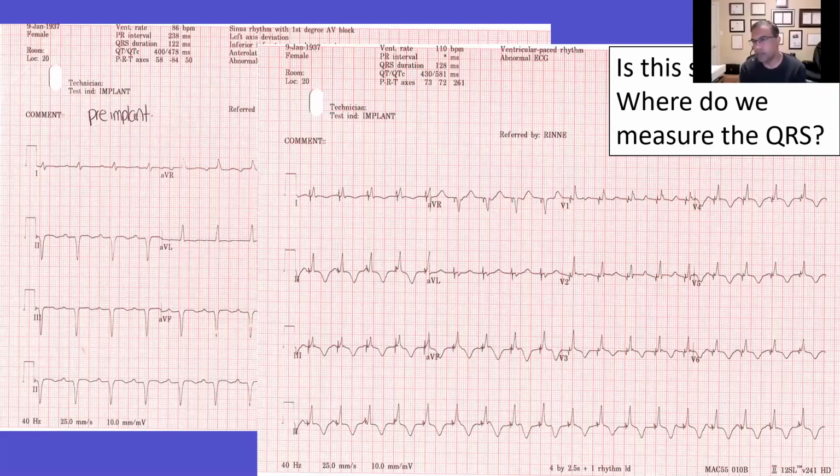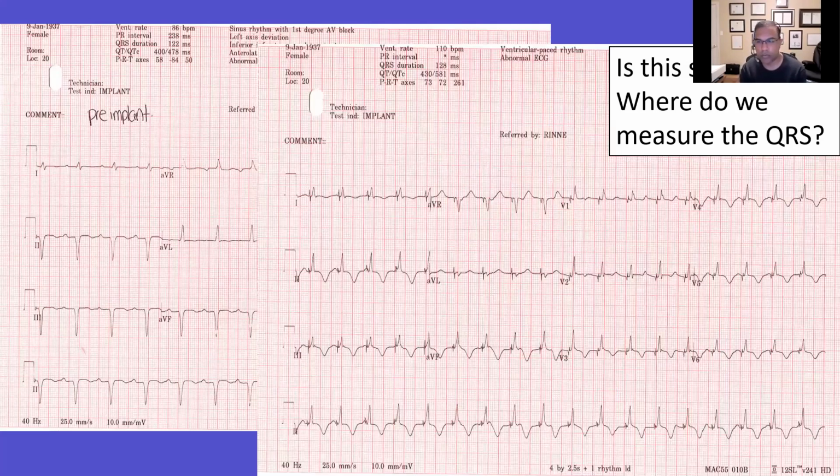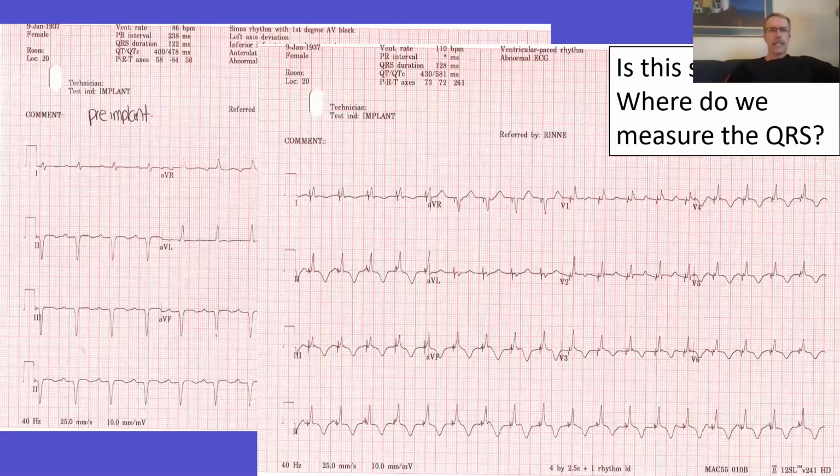It's usually measured in V1 by convention. Whether that is the right place to do it or the wrong place, that's where it is measured. And for the purposes of our combined database with VCU, that's what we've agreed upon: latency will be measured in V1 and QRS duration will be separate from the latency. However you define it, the important thing is that it's done consistently.